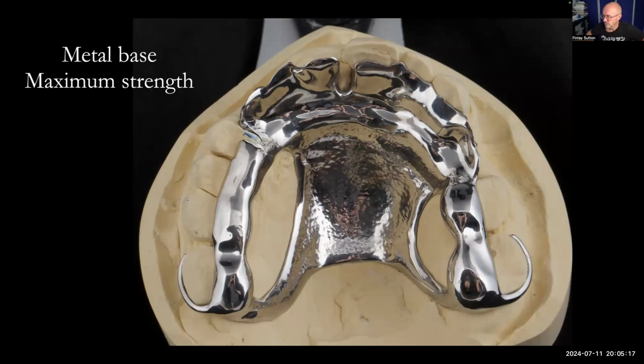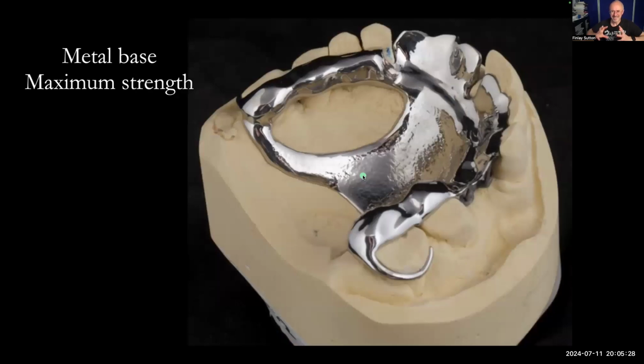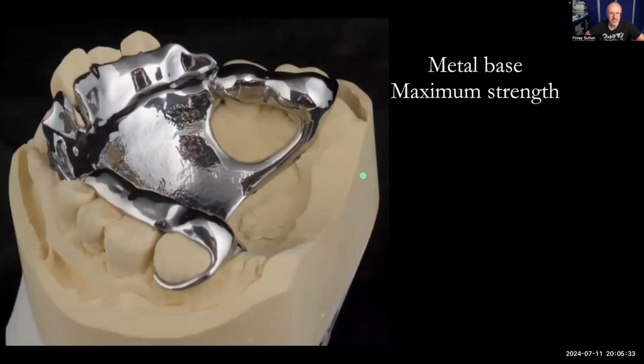So Mustafa, thank you. That's great. So Naringa, this is the metal base there, and I try that in without the teeth on. I don't put teeth on it at this point. I think from a practical perspective, it's better to try in the chrome totally bare, so I know it's fitting without the teeth being on it in wax, because they can just get in the way. And I don't know what's holding it off if it's not fitting properly. So good luck, Mustafa, with your ISFE next year.